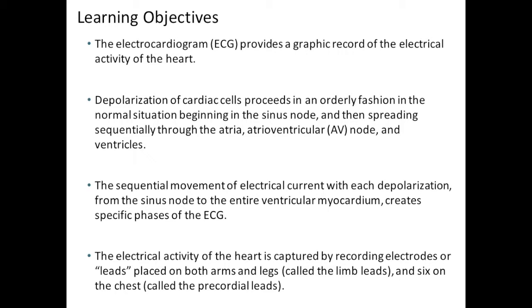And lastly, the electrical activity of the heart is captured by recording electrodes, or what we otherwise call leads, that are placed on both arms and legs, as well as on the chest.